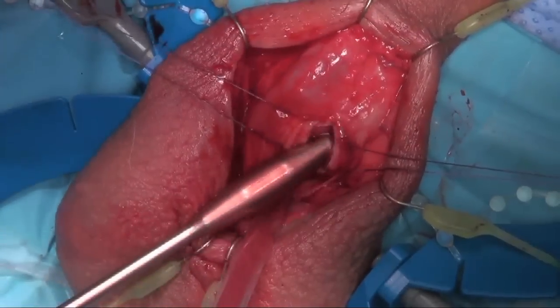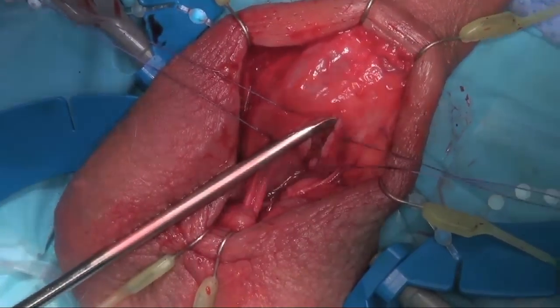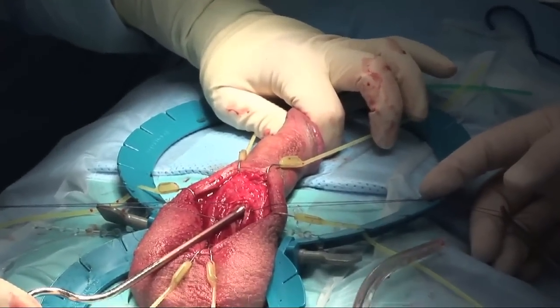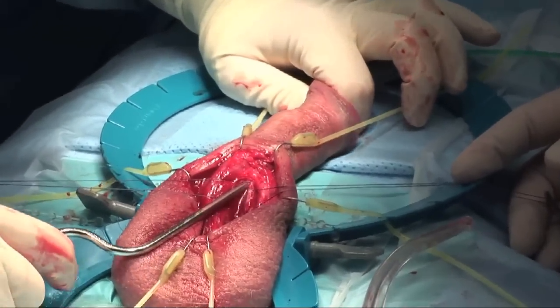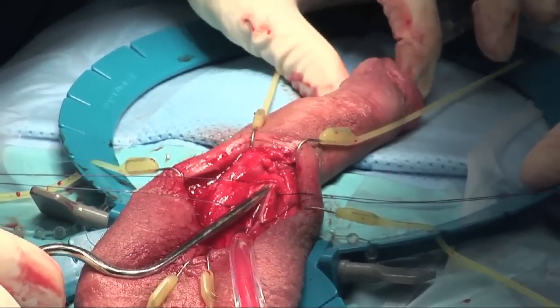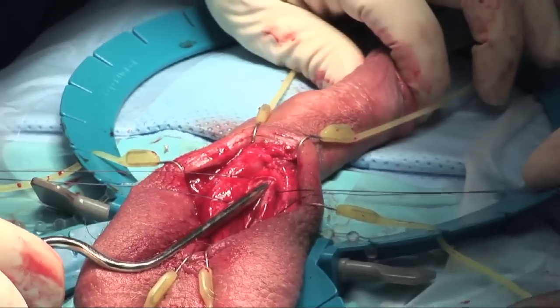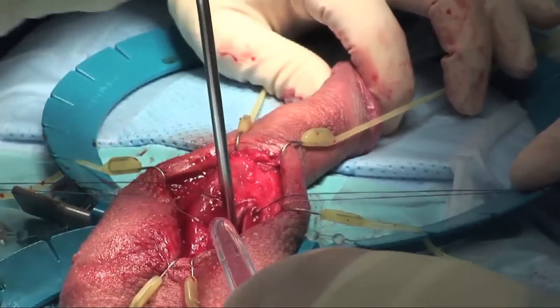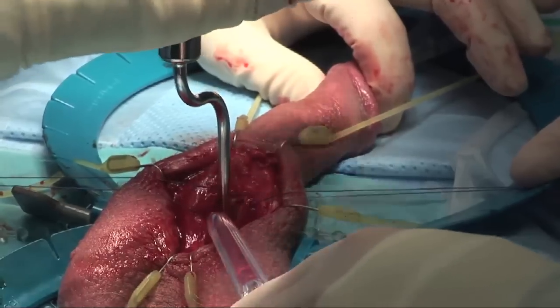And then I'm going to dilate out. I start with an 11 Brooks — you can use the Hagar's. Notice how I'm pinching the fossa navicularis with my other hand and turning it contralaterally. Notice how I'm indenting laterally. The key is to stay lateral during dilation — all the trouble is medial. Going up and down, staying lateral, I'm all the way down on bone very firmly. Very nice dilatation.